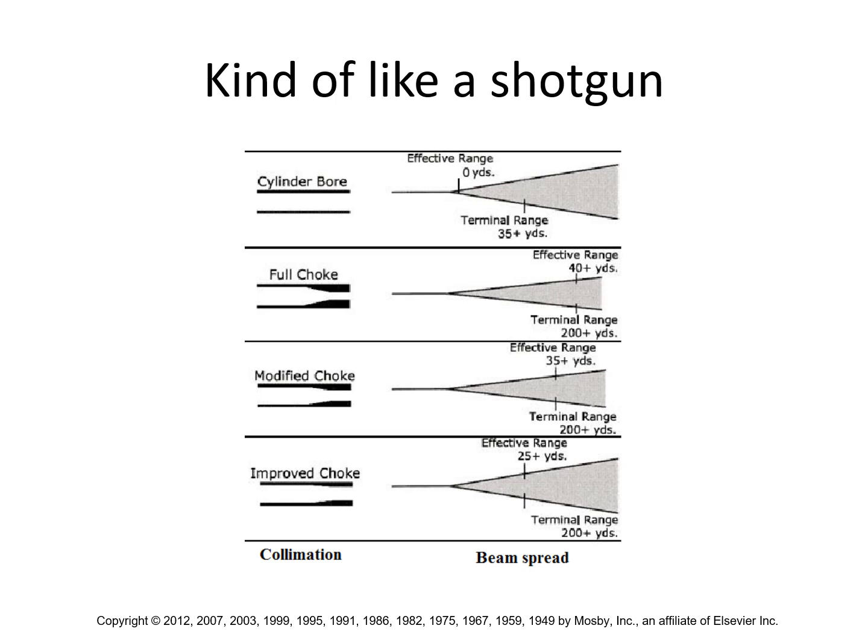Now, how does this correlate to an X-ray beam? Well, we have things called collimators that control how much the beam is spreading. It's a set of lead shutters. We've got some arranged horizontally and some arranged vertically, and they trim the beam in to the desired size, and that's what collimation means. Because you don't always want to shoot a full 14 by 17 field.